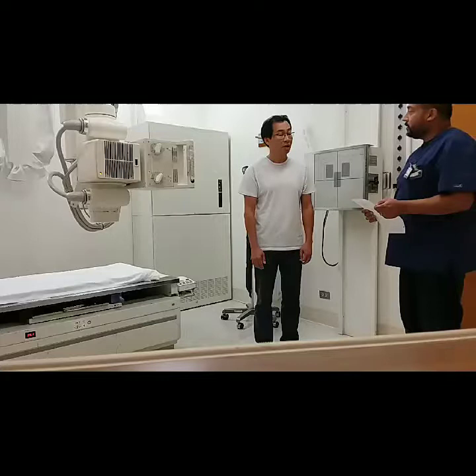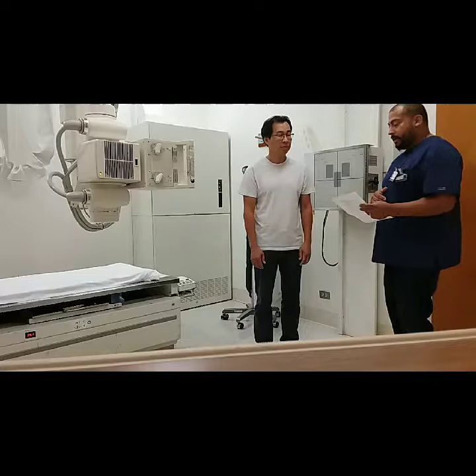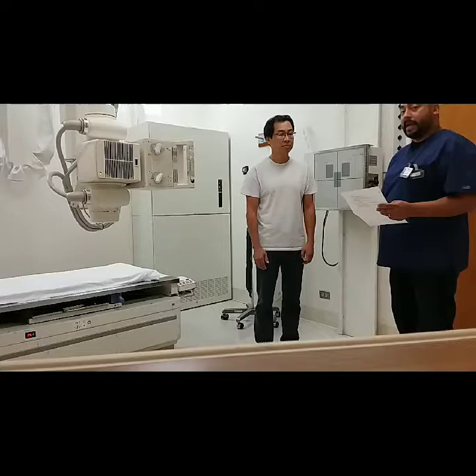John Chen — and your date of birth? 1/1/90. I asked the patient to verify his birthday and his name against what I have on my requisition, and it all matches up. I now have a history that he's had shortness of breath going on for about a week, which we can note.